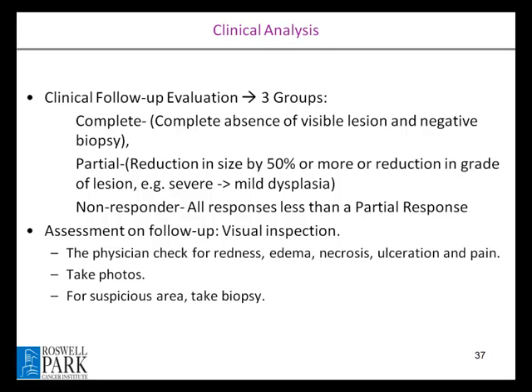They check the redness, edema, ulceration, necrosis, and also take photos. For suspicious cases, they can take a biopsy again. It would also be interesting to add another imaging there so they could do correction. Our instrument can do this part too, and it will be interesting to implement.